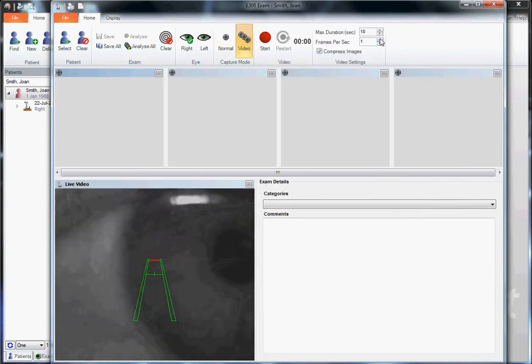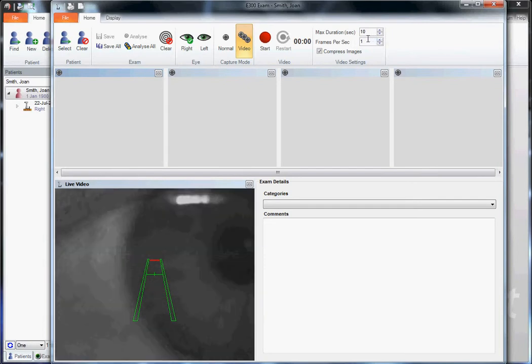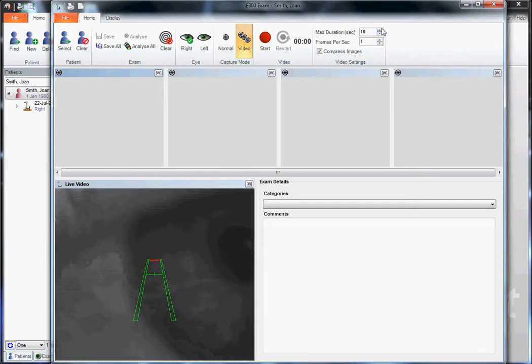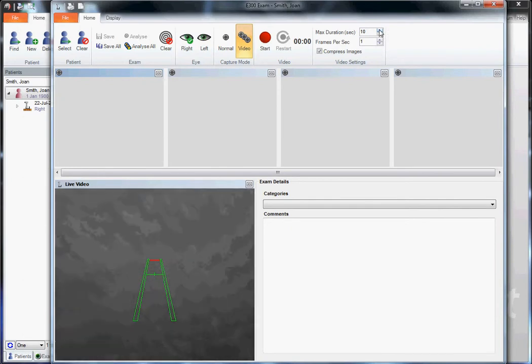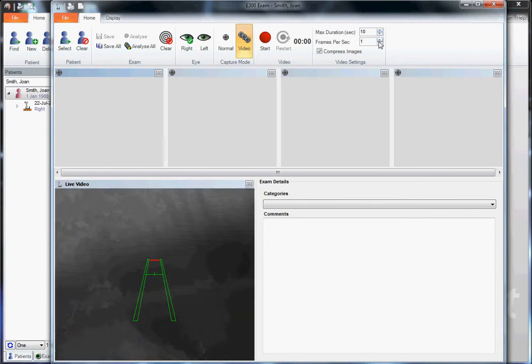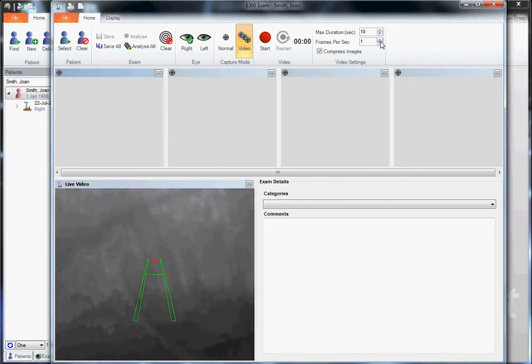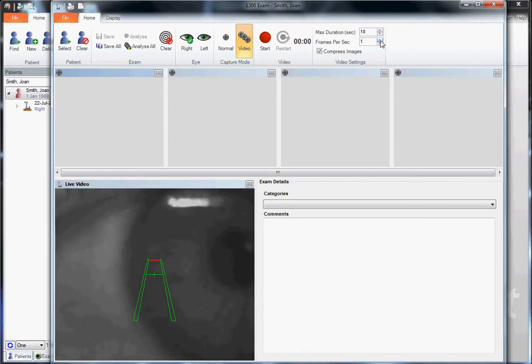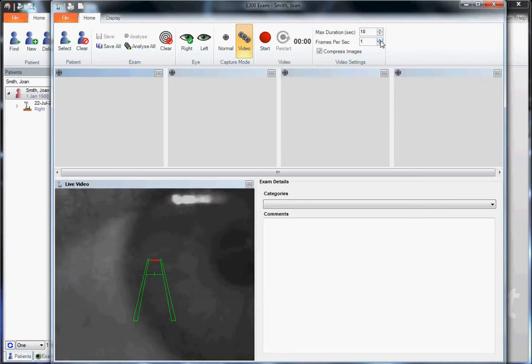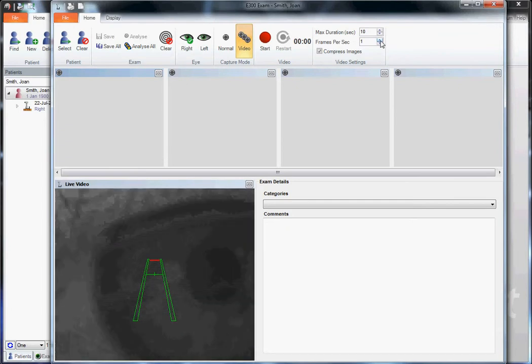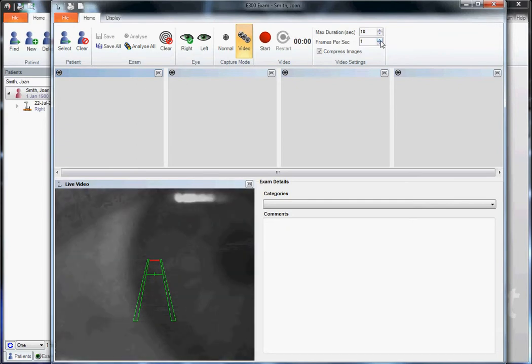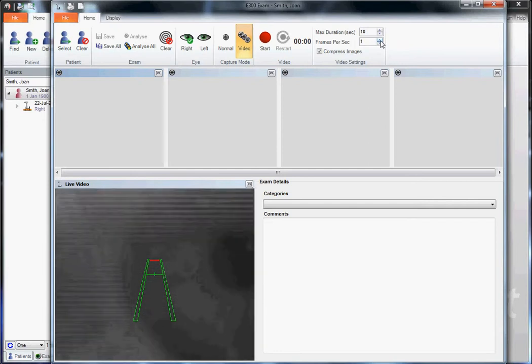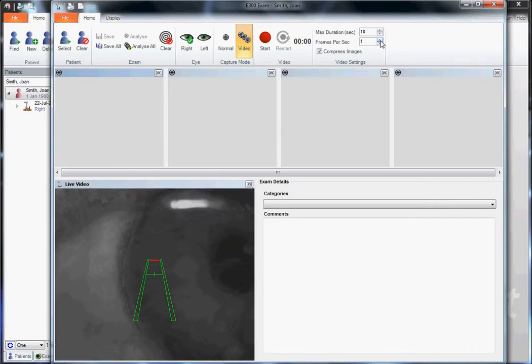Once that window is open then you can choose to go for a certain duration. In this case the user selected 10 seconds, and we can take as many images per second as we desire. Generally one image per second is enough to do an analysis. Any more than one may be too many images for the user to go through. Additionally it can create a lot of data on your hard drive.